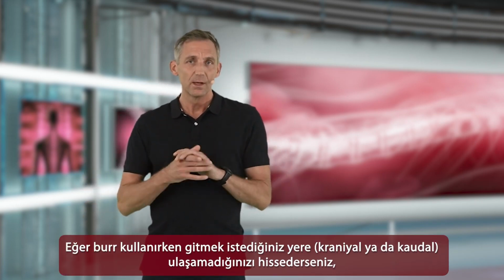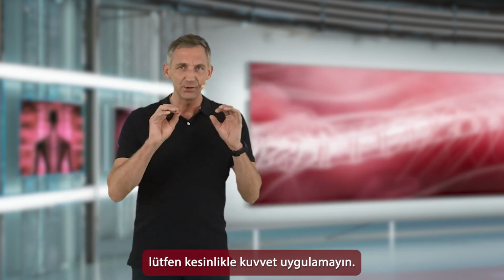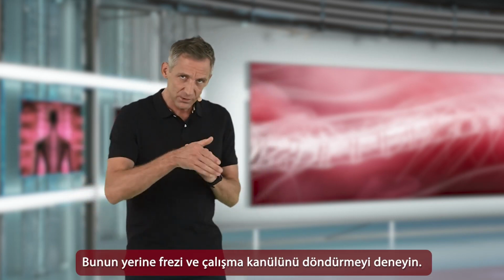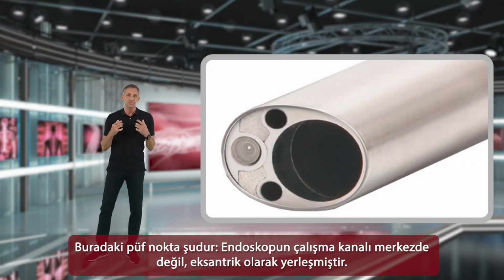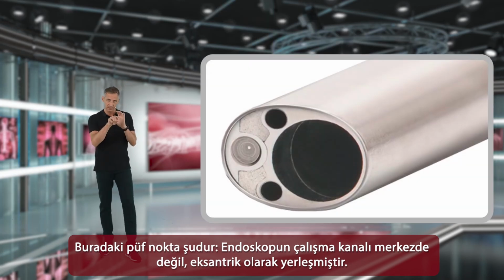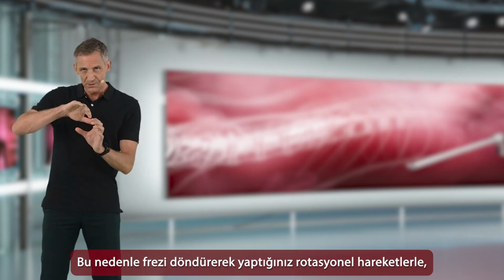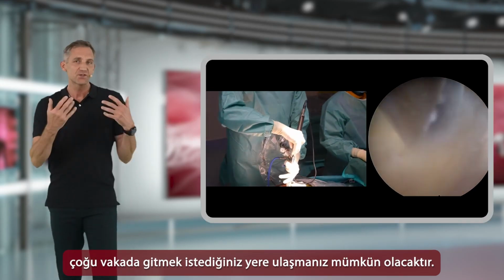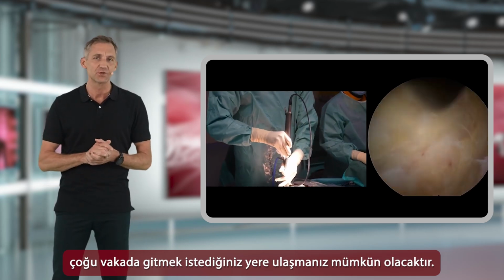So if you use the burr, and if you get the feeling that you cannot get there, you want to go cranially or caudally and you cannot get there, again, please don't use any force. Rather, try and rotate the burr and the sleeve. And the trick here is, please remember that the working channel of the endoscope is not located in the middle, it's not located centrally, but it's rather located eccentrically. So if you rotate the burr, and by doing these rotational movements, this should also help you to get anywhere where you need to get in the vast majority of cases.